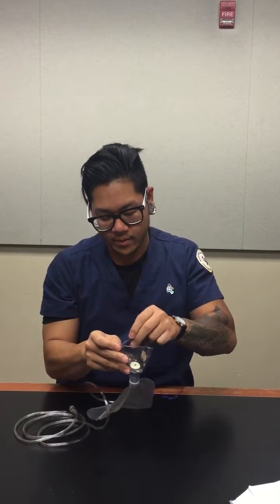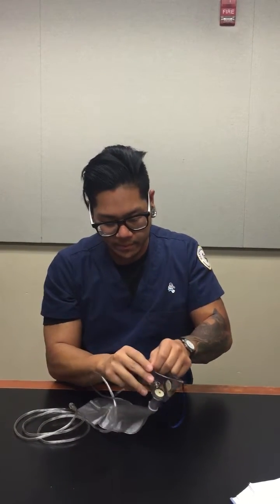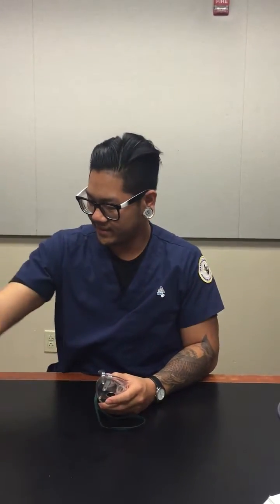Okay. And we're going to move on to air entrainment. This is an air entrainment mask, and I'll simulate after I'm done explaining. But this is also known as an AEM and a Venturi mask, and this is a high flow device system. The flow range for this is greater than 60 liters per minute, and the FiO2 is from 24 to 50%, and the FiO2 stability is fixed.